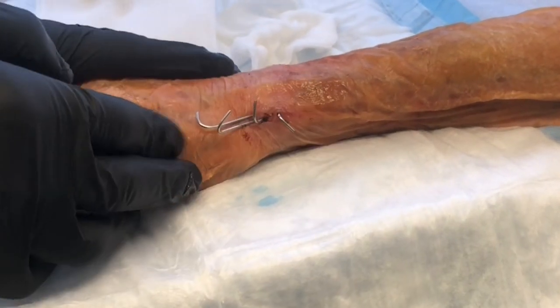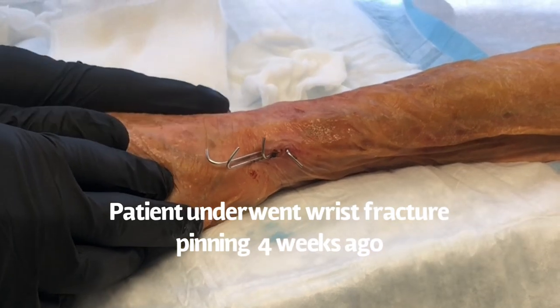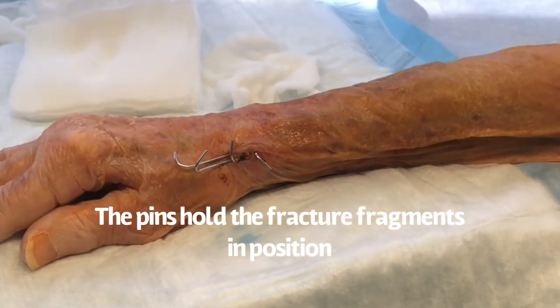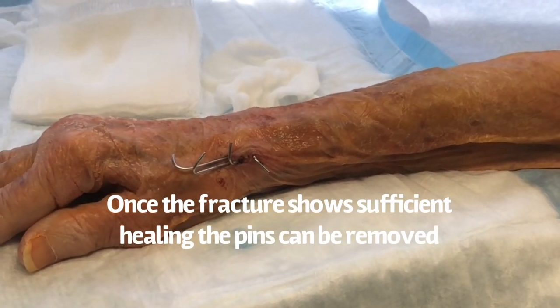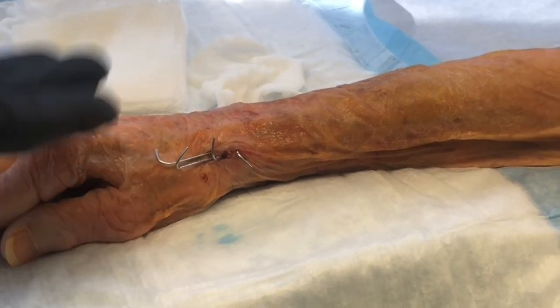I just wanted to demonstrate how pins are removed following a distal radius fracture. My patient was kind enough to allow me to record this. So distal radius fracture, percutaneous pins — percutaneous means that they're sticking out of the skin.